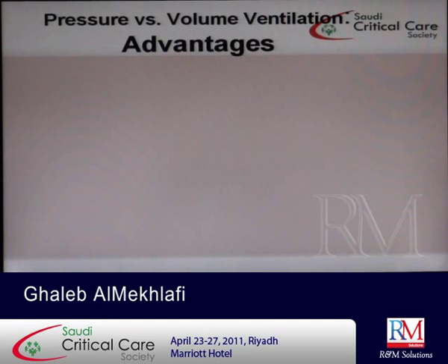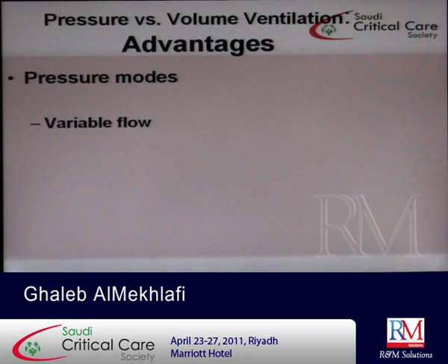Okay. Now, what are the advantages of pressure and volume modes? In pressure modes, we have variable flow, which makes the patient more comfortable, because if the patient has a stiff lung or chest wall and the flow is constant, at the same rate, the patient will not be comfortable.